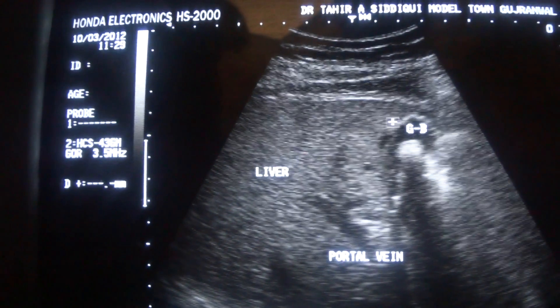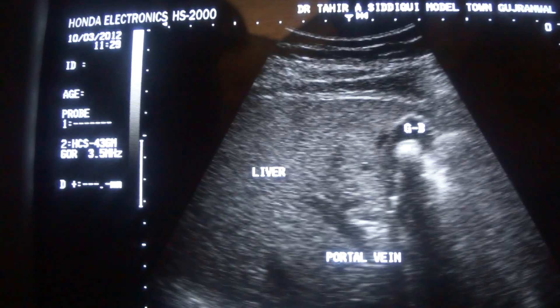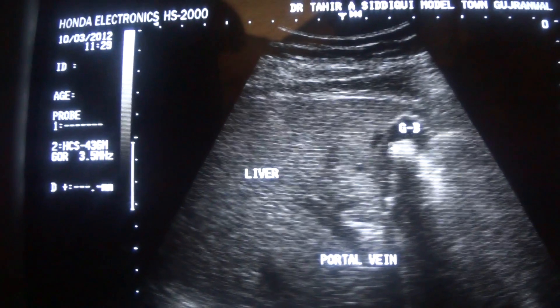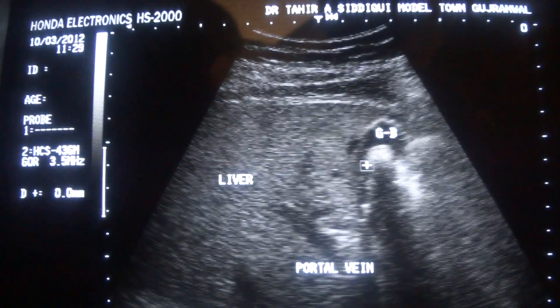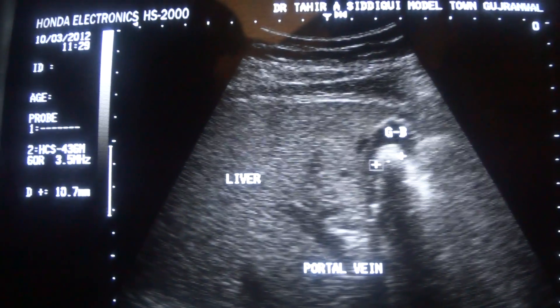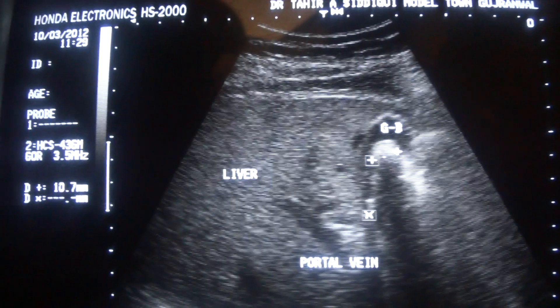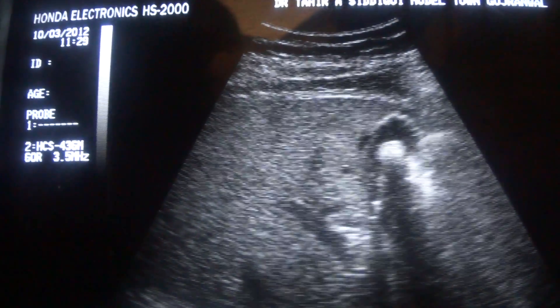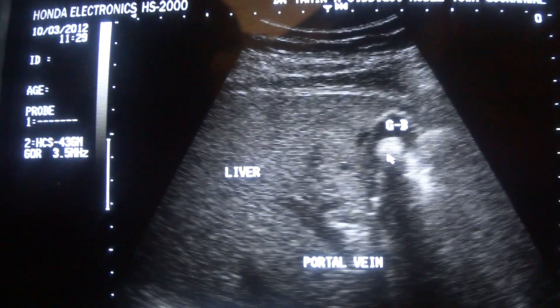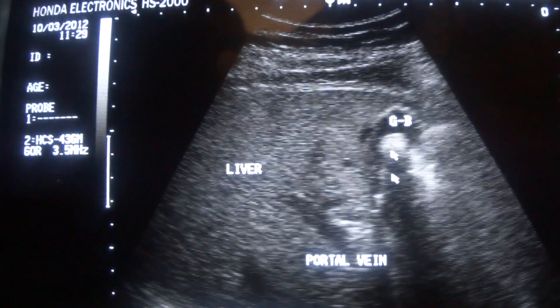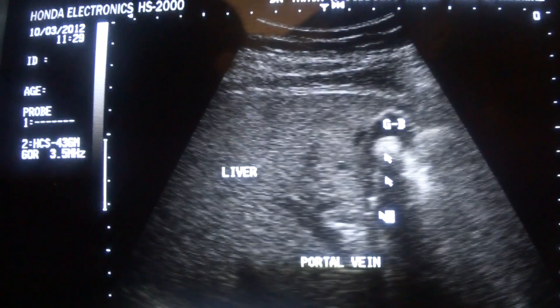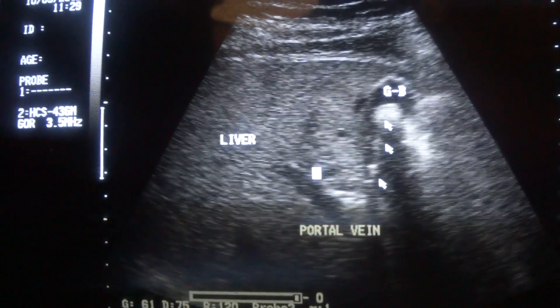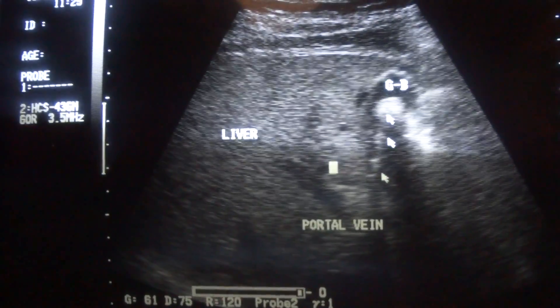In the lumen of the gallbladder you see echogenic areas giving posterior shadowing. This is the largest of them, and these are a few tiny calculi. This is the calculus. This is the calculus. Here lies the calculus. If you see a tubular structure, this is the common bile duct.